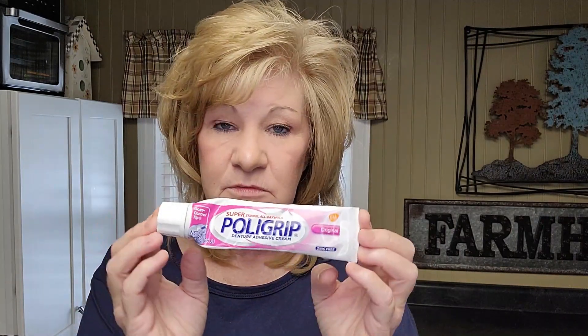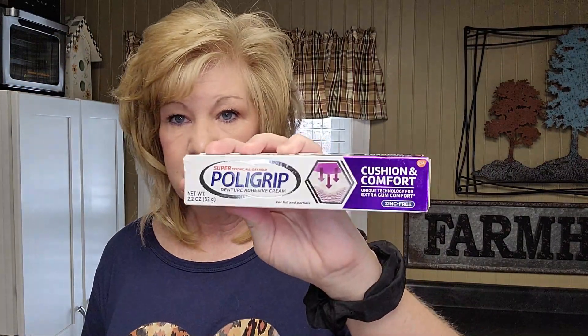My next one on my list is Poly Grip. It kind of holds — it'll hold my top and the bottom again if you add powder — but this one I'm not a fan of. It's okay, but I've heard a lot of people say it doesn't really work well either.